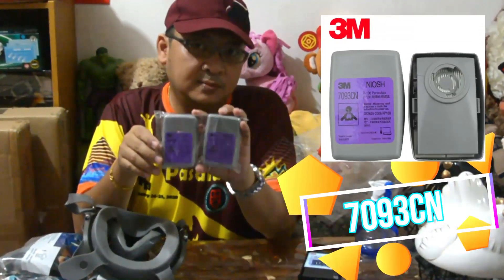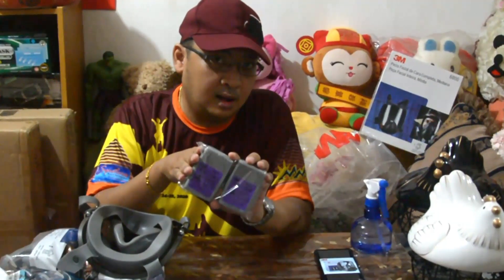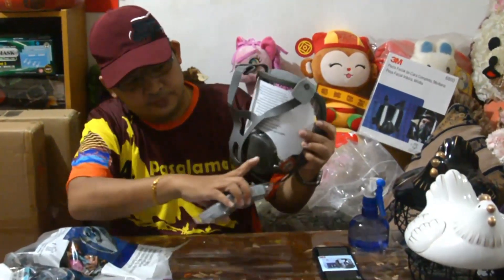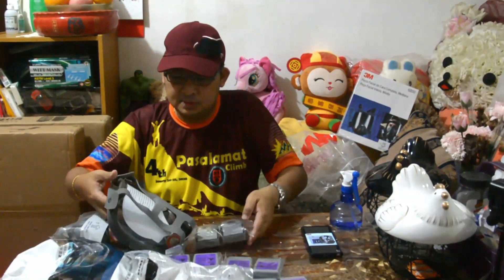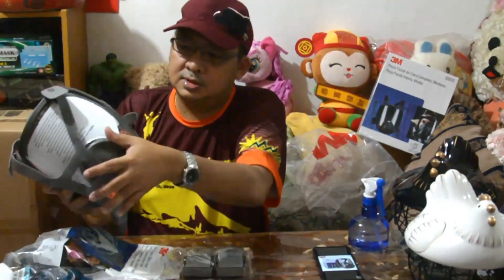Itong 7093CN 3M filter ay, may nasasabi na iba ay good for 60 days. Pero magtanong ako doon sa supplier kung saan ko itong binili — ito ay good for 200 hours, 5 to 7 days. Initapon mo na pagkatapos ng 7 days. Ito ay ilagay sa gilid dito. Dito siya, kung paano siya lihisan — with tissue lang, kunasan mo dito, silaling, at saka yung mask mismo, kunasan lahat-lahat sa loob dito ng with tissue. Or sprayan mo ng alcohol, tapos with tissue.